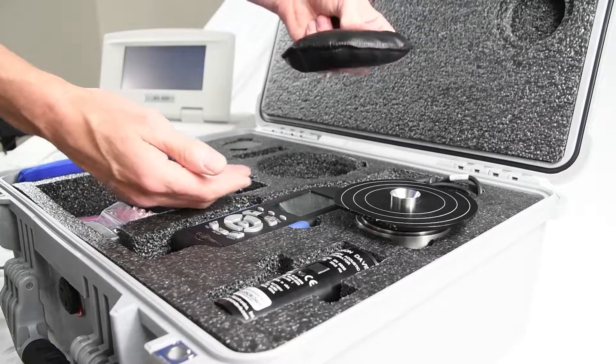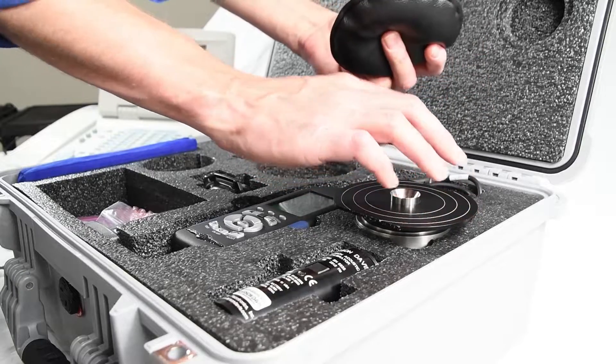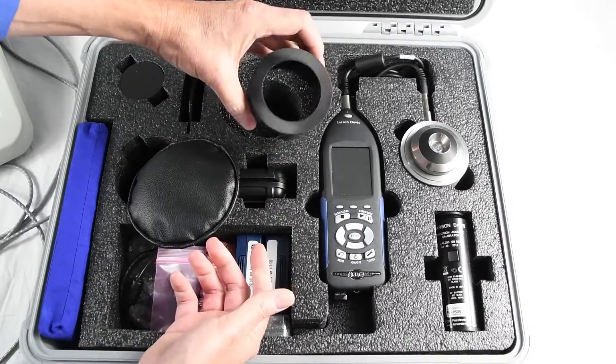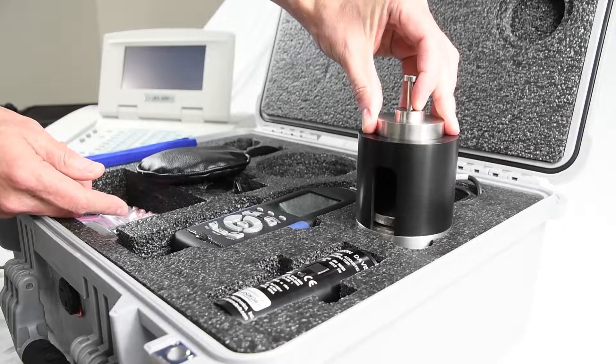The weight bag and IEC Type 1 adapter keep the circumaural headsets firmly over the coupler. This retaining ring is used for the bone vibrator or even supra-aural testing along with the mass handle weight.